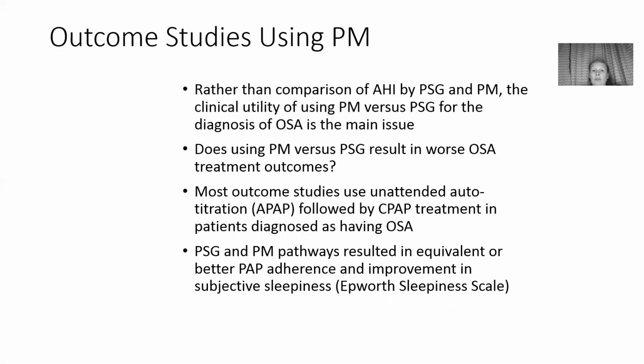Well, what they found is most outcome studies use unattended auto-PAP followed by CPAP treatment in patients diagnosed as having OSA. In-lab sleep studies and home-monitored sleep study pathways resulted in equivalent or better PAP adherence and improvement in the subjective sleepiness.